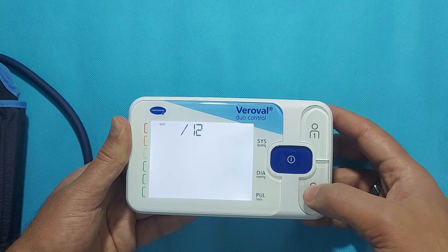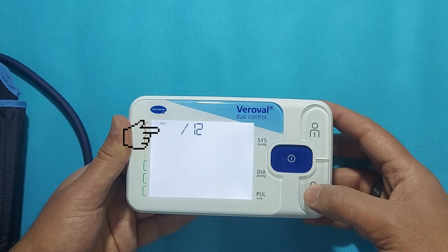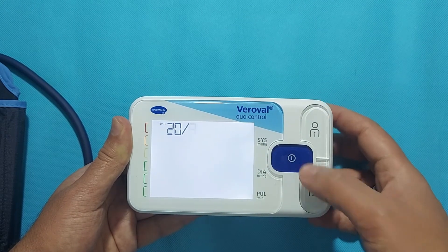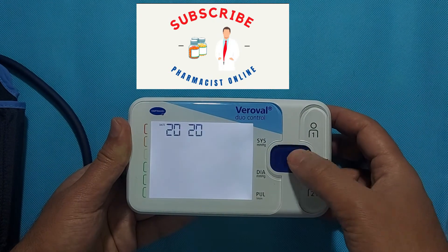After the battery installation, the settings will appear in the top left corner. Set the device date as shown in this video. By pressing the User 1 and User 2 buttons, you can select a date and confirm it by pushing the Power button.